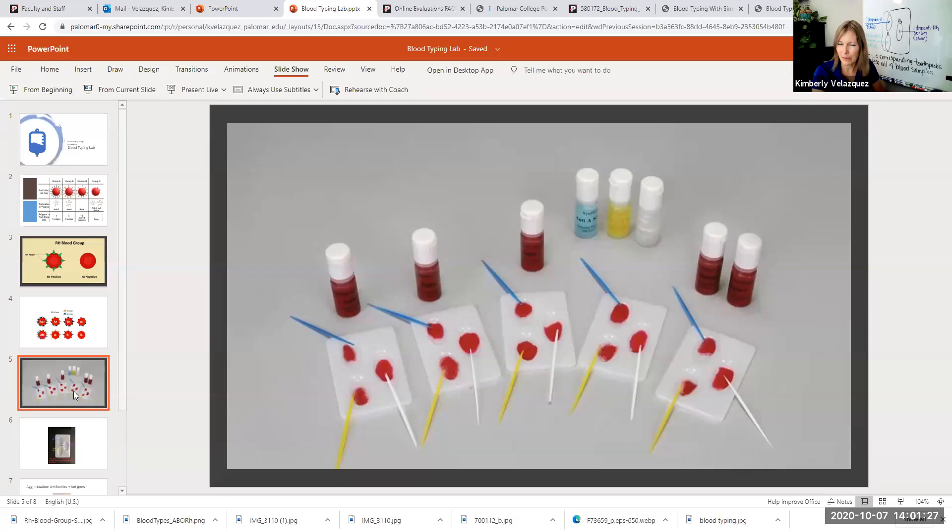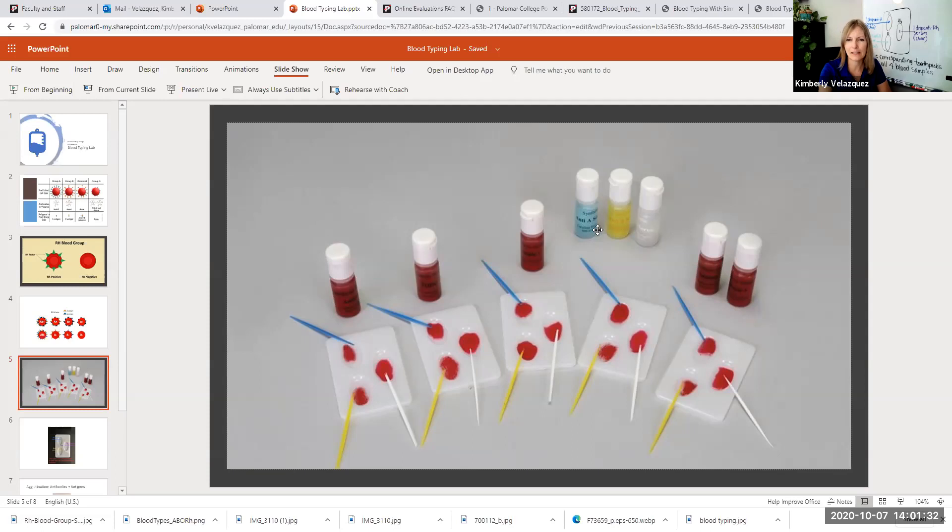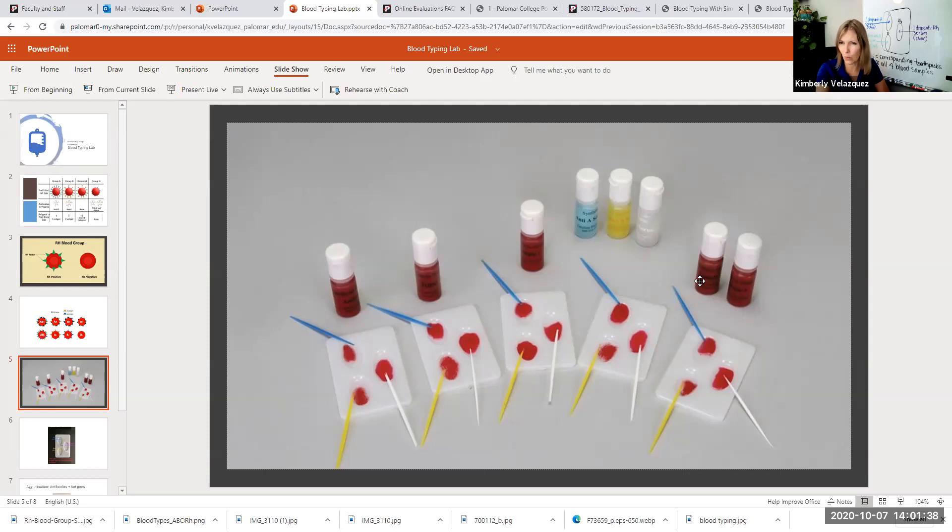This is a picture of a test kit that's a little bit different from yours, but it does have the exact same three anti-serums. And then you only have four synthetic bloods and you just have one test tray.